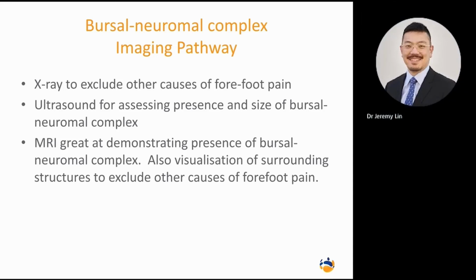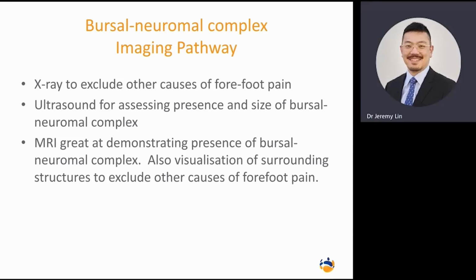MRI is great at visualizing this particular lesion and also assessment of the surrounding structures. However, this is probably not one of the conditions where I would recommend going to MRI in the first place.